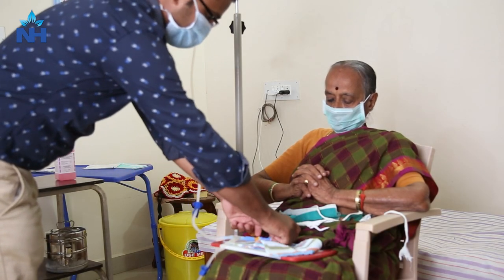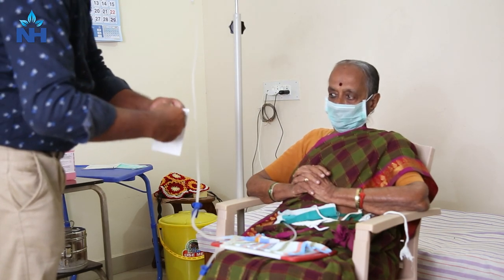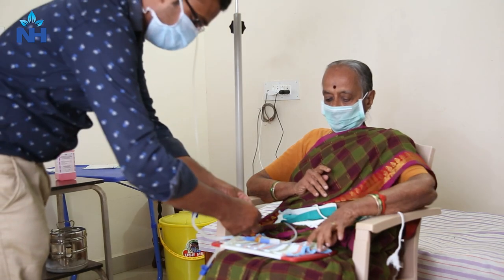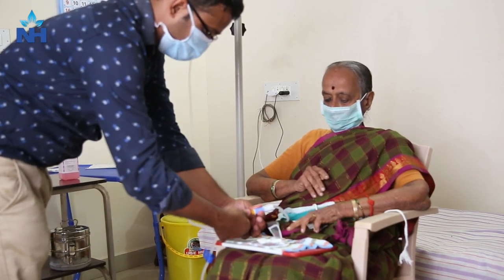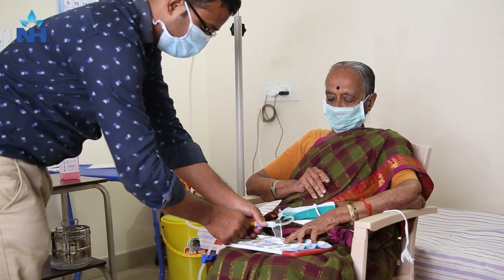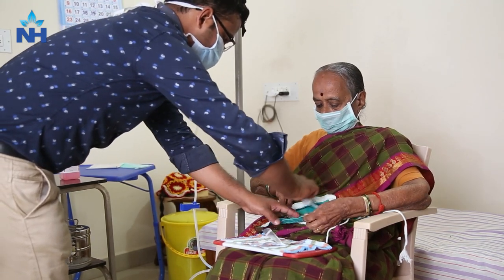So this is the simple process of peritoneal dialysis. In about another five minutes, the fluid will be inside. Vamshi is going to remove the bag, put a cap on the catheter, and the patient will roll the catheter into a small pocket that she always wears — and she is free to walk around, do all her work at home, or even go out for shopping. This gives patients a lot of freedom to continue dialysis at home without having to come to hospital every other day. We will hear from Mrs. Shivaraman a bit later about how she is feeling. I hope you've understood the basic principle of peritoneal dialysis. Thank you very much.